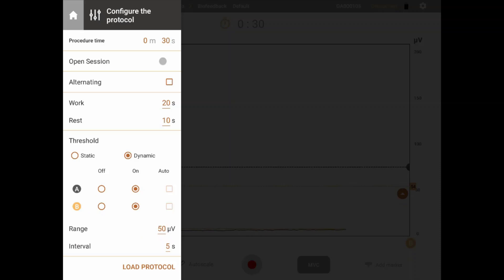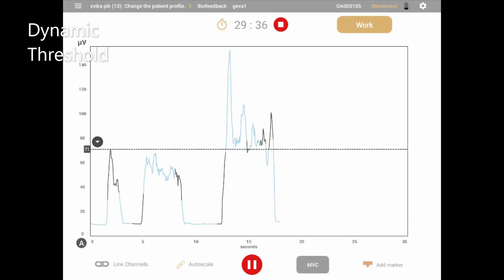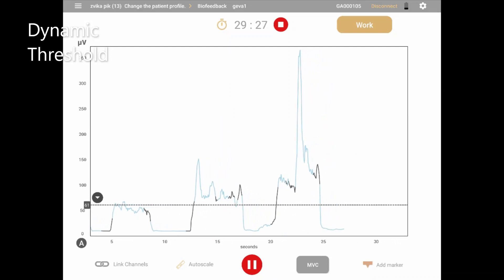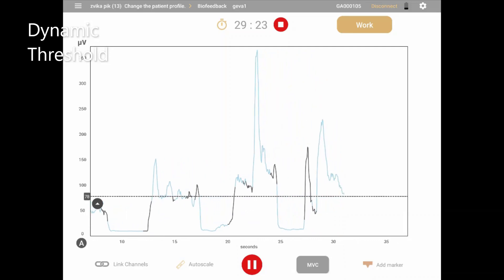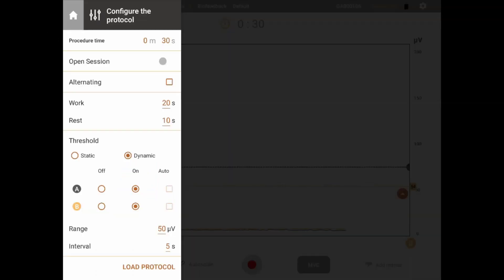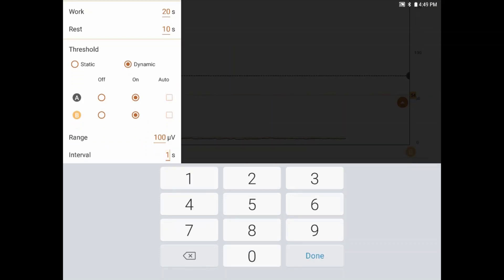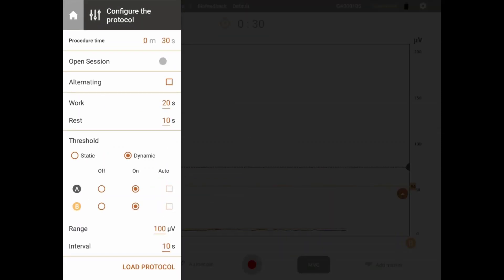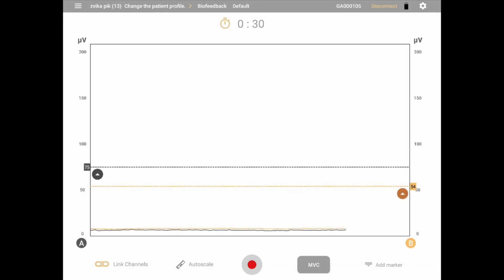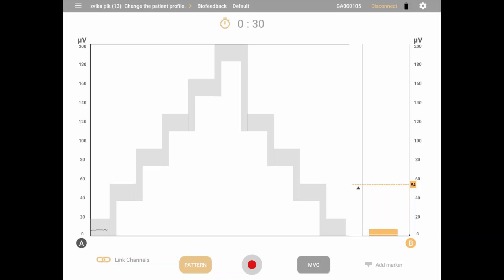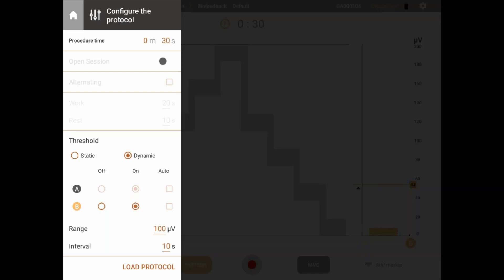Dynamic mode is a different type of threshold. It will jump up and down randomly within a set range of amplitude every set number of seconds, asking the patient at times to reach above the threshold and at times below, providing a more complex moving target goal for control training. After selecting dynamic threshold on the bottom of the menu, you can set the range in which the threshold can move and the time intervals at which this will happen. While dynamic thresholds are turned on, the initial threshold value can be selected before starting the session. Once the session starts, the threshold will move within the given range and will not be available for manual adjusting. In pattern view, threshold settings are only applicable to channel B, as the pattern itself represents the threshold for channel A, with the condition being within as opposed to above or below.